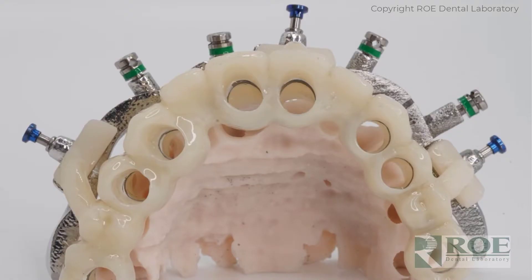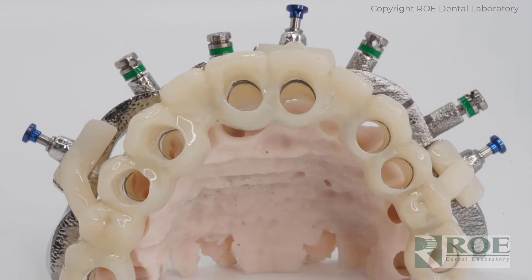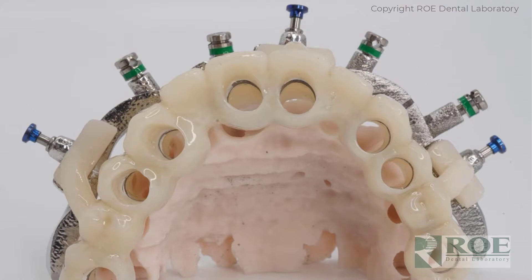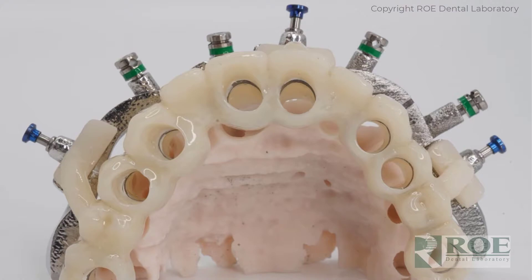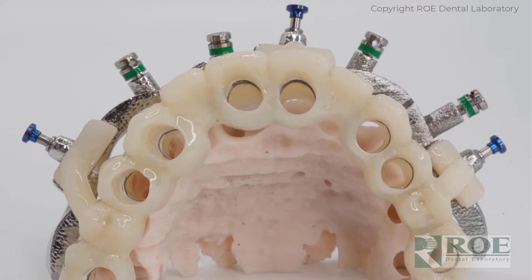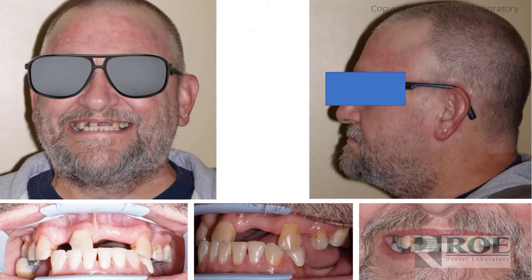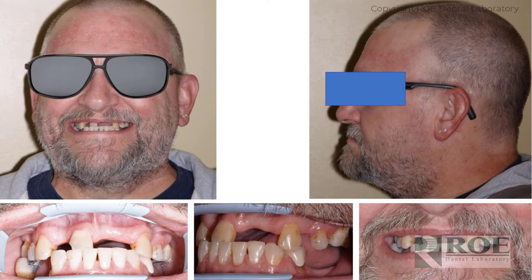This video will describe Chrome Natural — the delivery of an FP1 device on a Chrome Guided Smile platform. This case is a little bit unique because the doctor free-handed the implants. We did provide an osteotomy guide, but when the doctor was in the middle of surgery he decided to freehand. It happens from time to time. The case is intended to be guided, but we wanted to share it anyway. Chrome Natural and other variations of Guided Smile all follow the same protocol with records.